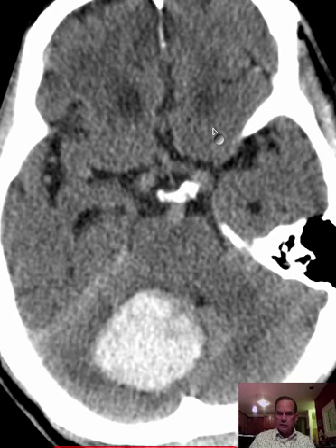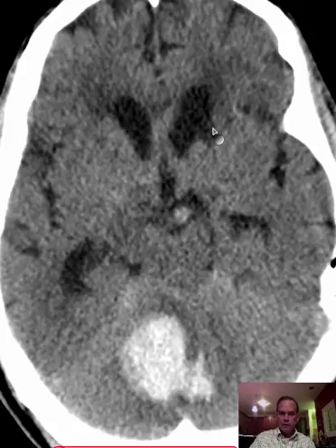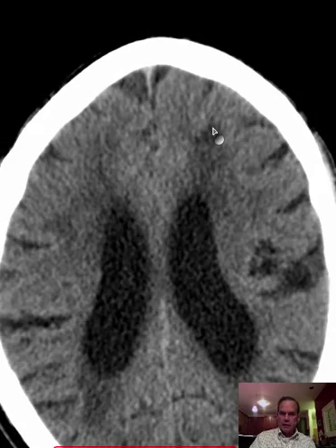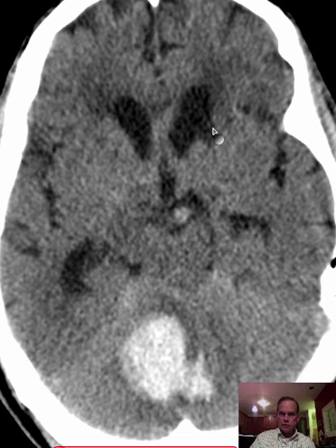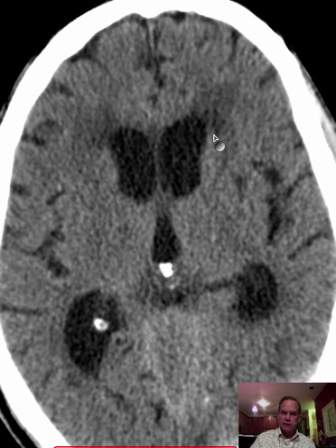In summary, this is a cerebellar hemorrhage with mass effect and shift of the posterior fossa structures slightly to the left, chronic white matter changes, and small lacunar infarcts — lake-like lacunar infarcts — in at least the left basal ganglia.